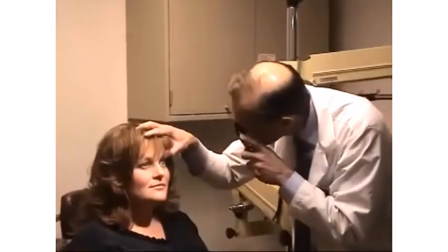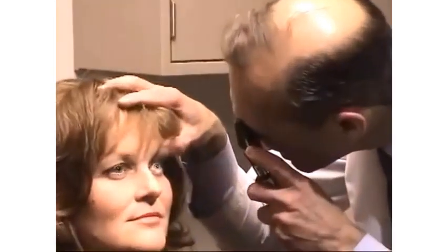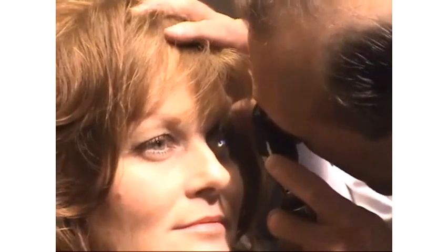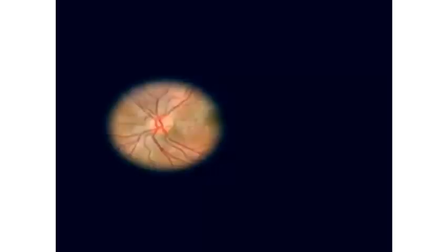There is an important rule called the right, right, and left, left. If I'm examining the left eye of the patient, like as we can see here, the doctor should hold the direct ophthalmoscope in his left hand and use his left eye, and vice versa for the right eye. We start to go from slightly temporal and aiming at finding the optic disc, which is located slightly nasally.